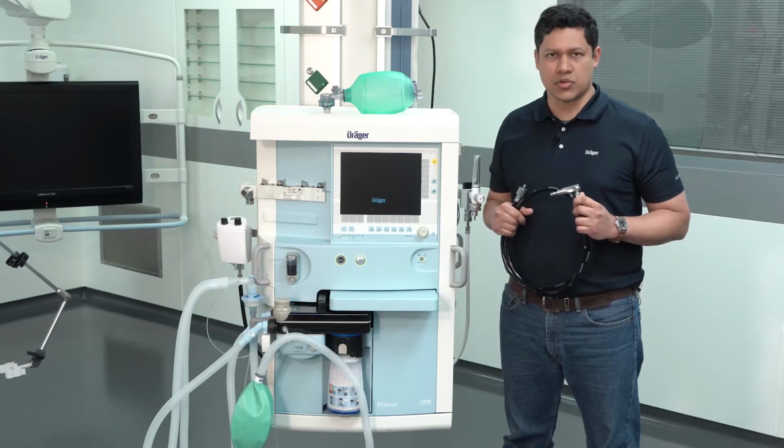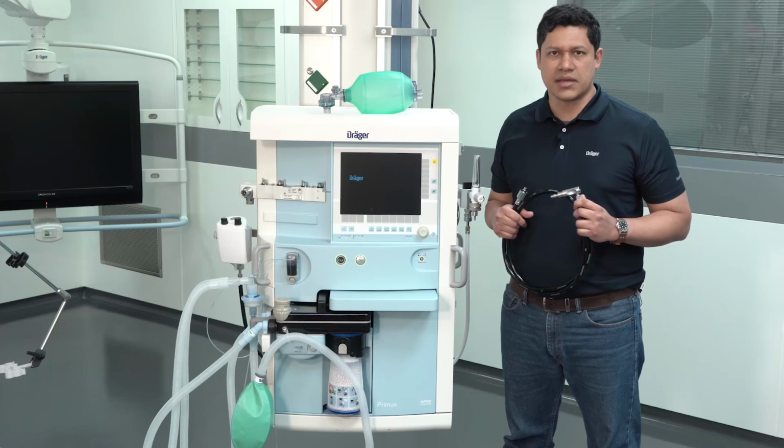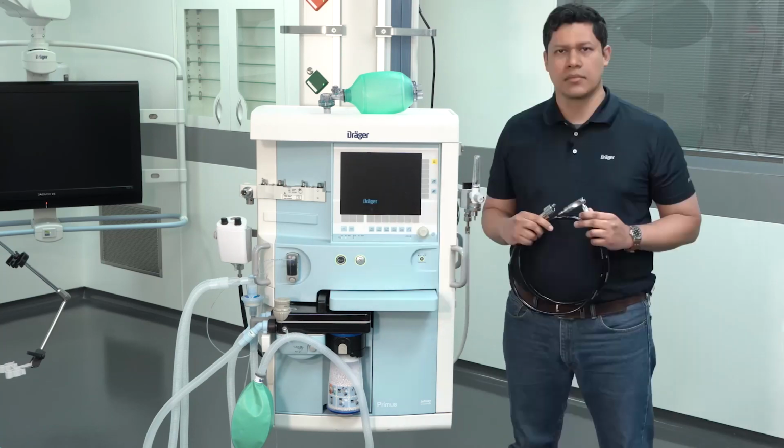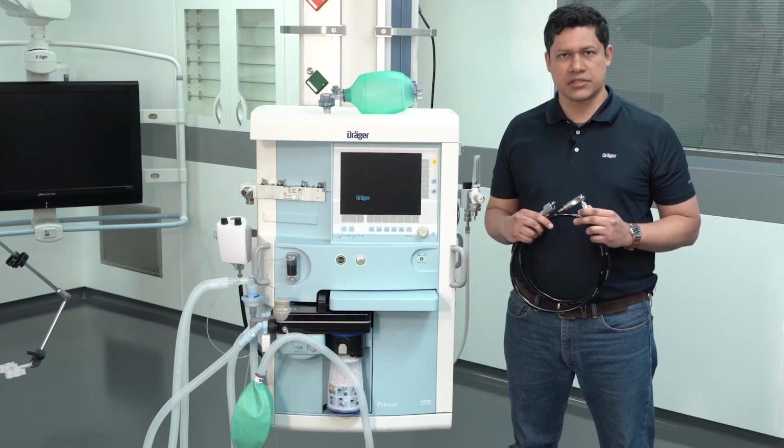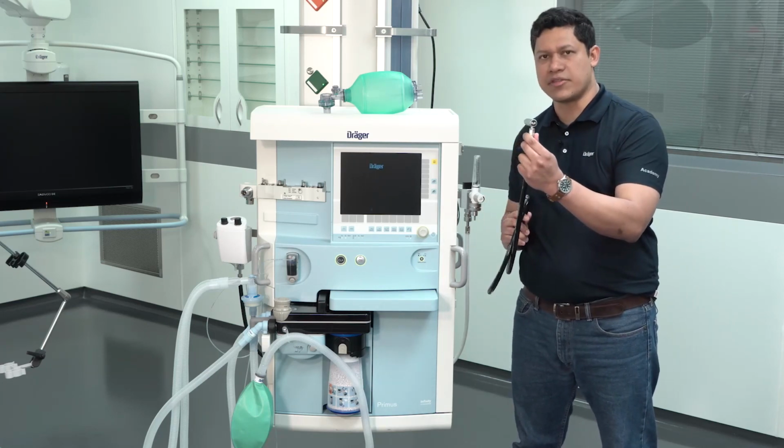Make sure nitrous oxide is not supplied to the anesthesia device. Disconnect the nitrous oxide hose from the source. Make sure you first disconnect from the source, and then you disconnect from the back of the anesthesia device.